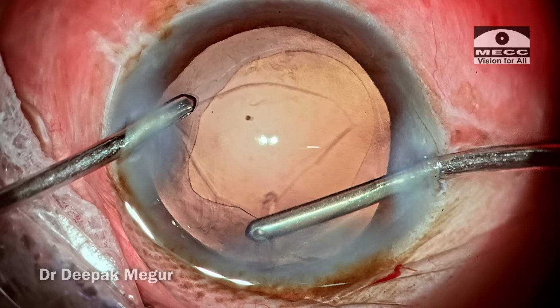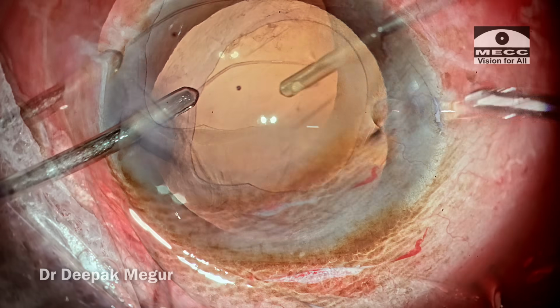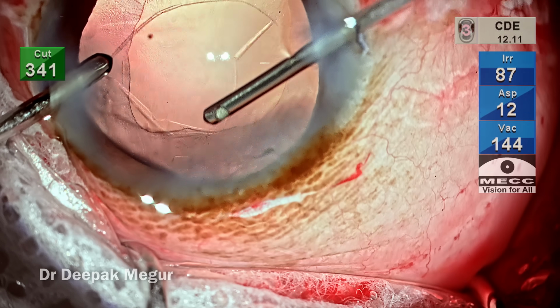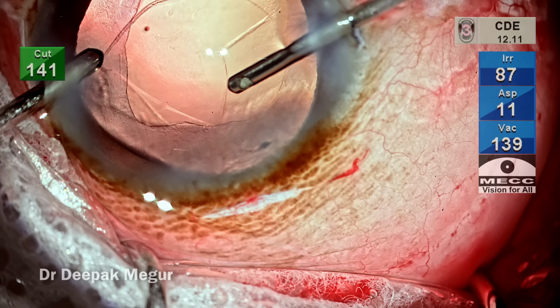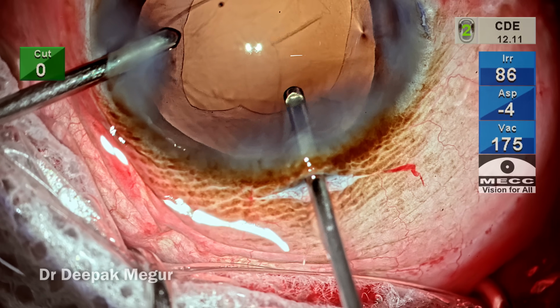Again, there seems to be a small fibril there. Now, before putting in the lens, I just want to go ahead and take care of this one prolapsed vitreous fibril one more time. Finally, I think this single vitreous fibril is dealt with. Now is the time to implant the lens.